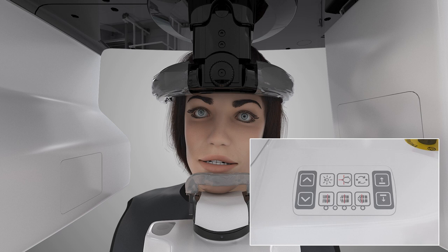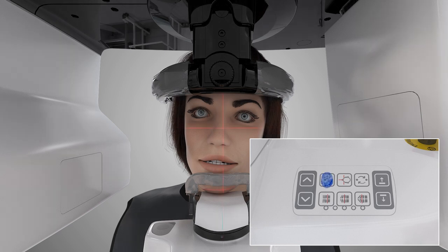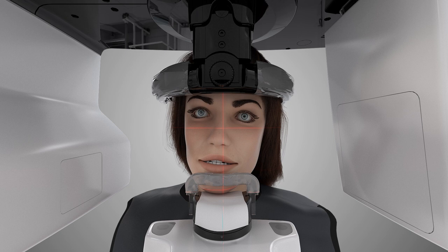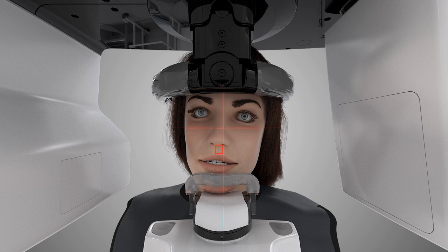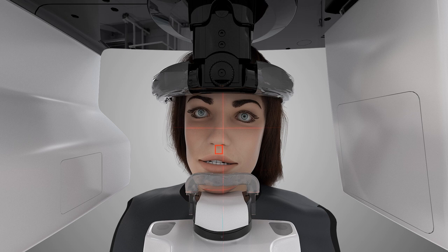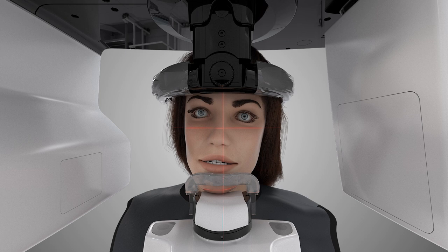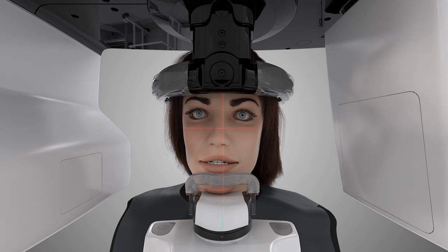Ask the patient to step forward to grip the handles and place their chin on the chin rest. To check the patient's head position, press the laser light button on the positioning panel. Three lights will appear. Align the midsagittal laser light — this vertical line should pass directly through the center of the philtrum. Ensure the patient's head is not turned or tilted. Compensate for misalignments by manually moving the patient's head into the proper position.